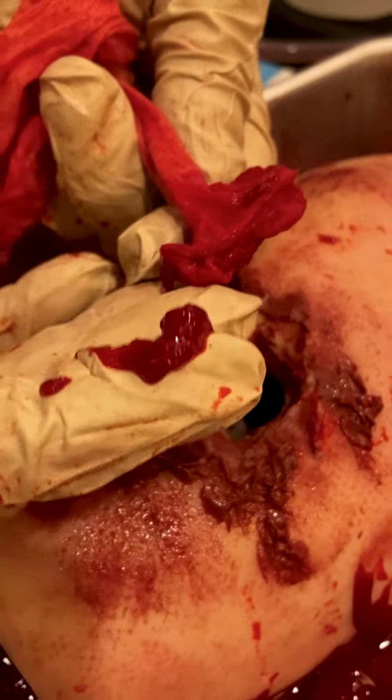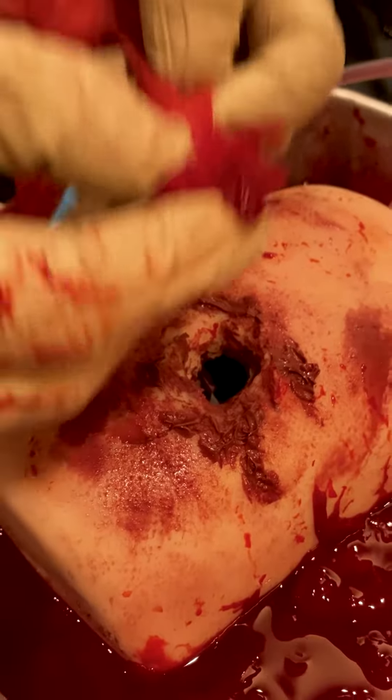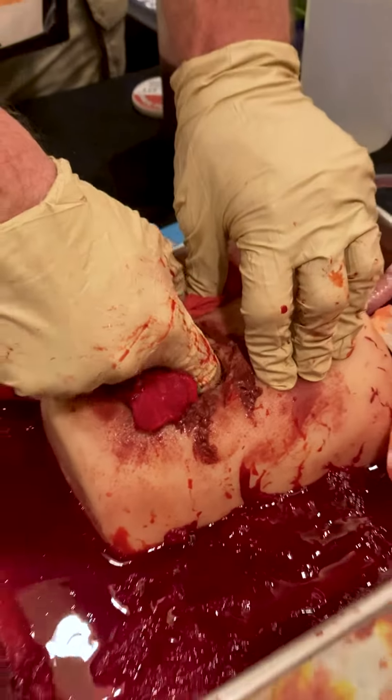This piece went right to the point of wounding. That is why it's so important — it doesn't matter what you're packing with, it's just so important that you get to the source of the bleed. And that is TruClot Products.